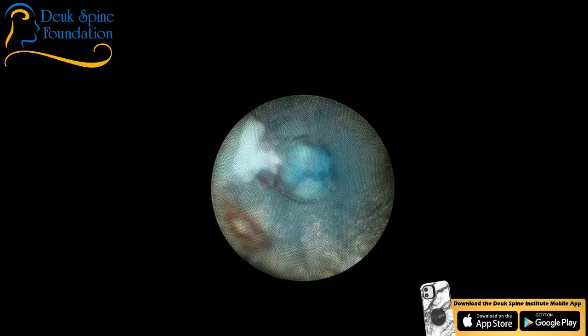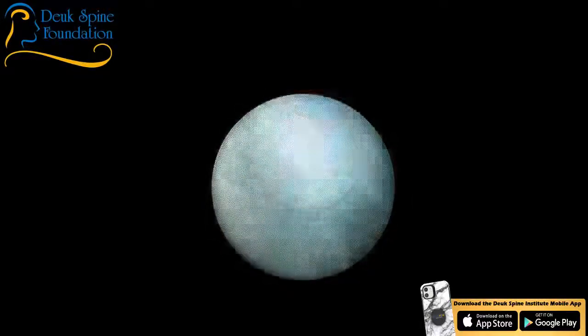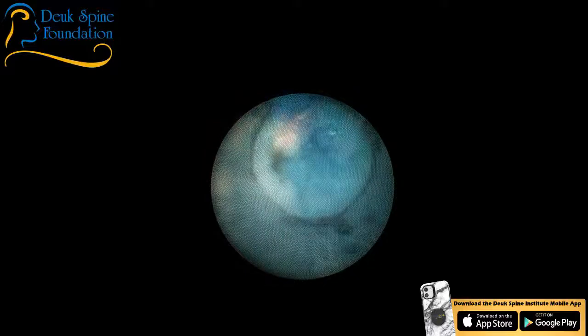And I'm going to bring the laser fiber forward so we can see it. There it is. And that laser fiber is going to deliver laser energy right to the herniation. And as it does that, it's going to break up the herniation into little pieces, and they're going to come out through the tube.